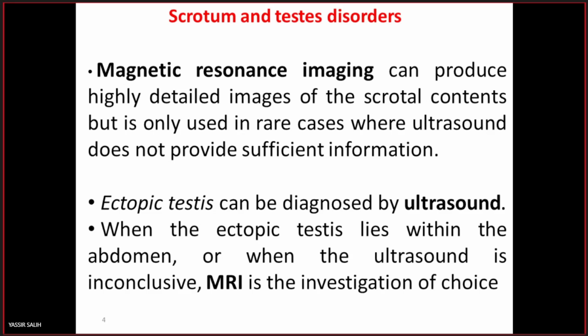As we mentioned, MRI can also be used for assessment of scrotal abnormalities, but usually we start with ultrasound, and if the ultrasound is inconclusive or provides insufficient information about the condition, at this time you can do MRI.